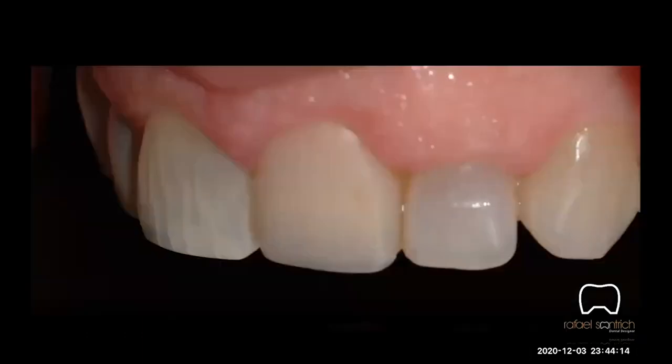So little by little, we are developing the technique, doing nice cases and showing our industry that the technique works, because sometimes people don't believe that different techniques work, compared with what we have been doing for so many years. This is a really important case: the wife of a dentist who worked with me for several years. He tried to maintain her tooth in the mouth for years, doing composite here, composite there. But the tooth has a big root resorption, some big lesions. So he decided to place an implant.